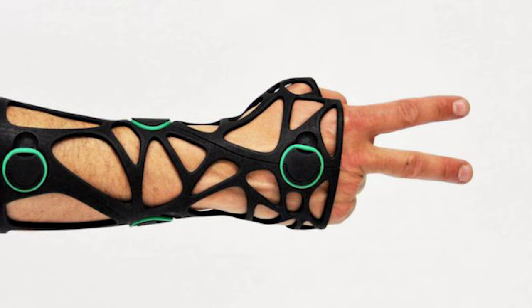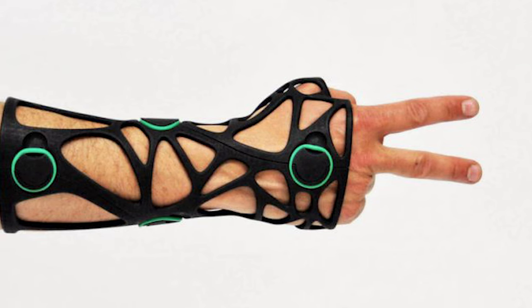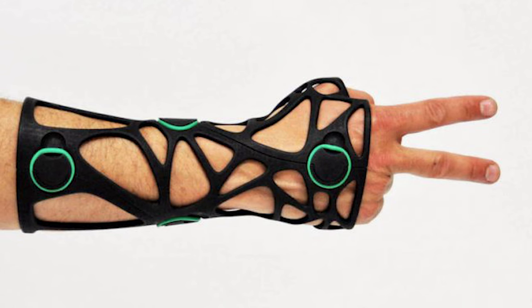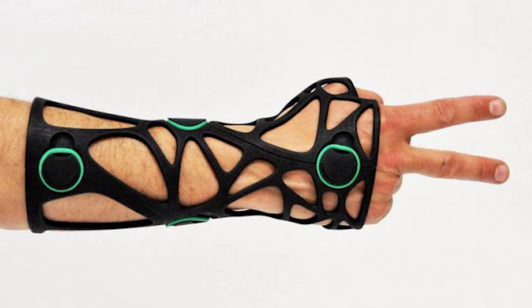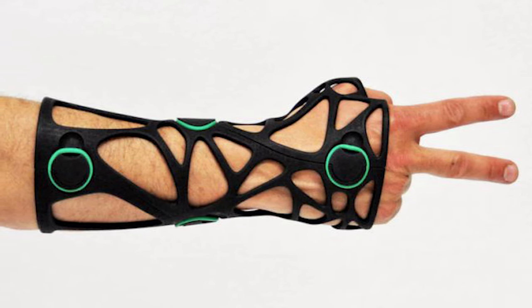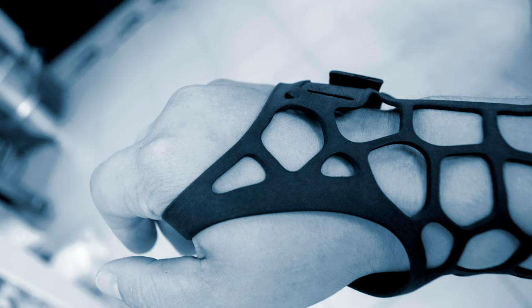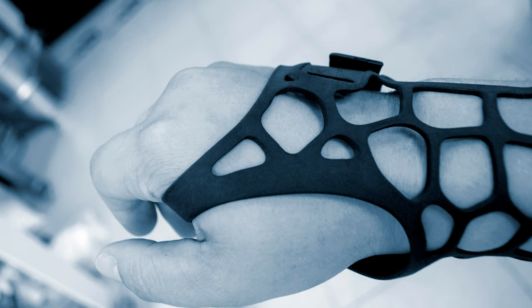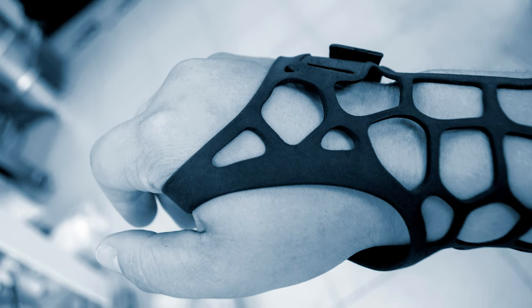3D printed casts are durable, lightweight, and do not restrict movement like conventional plasters. The casts can also be reused, which helps to reduce costs, as suggested by Escalate. Finally, the orthopedic cast can be remodeled and modified using the existing structure and less material.